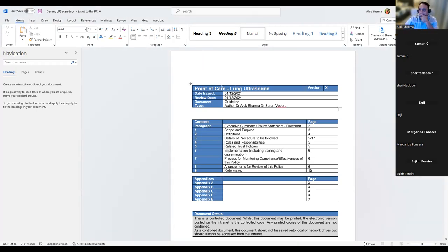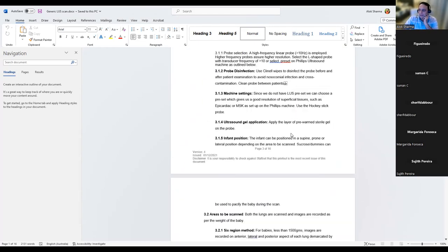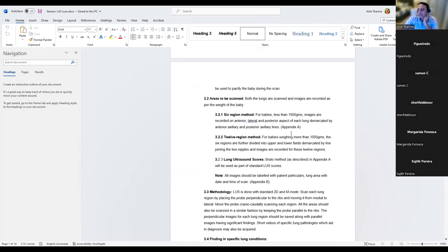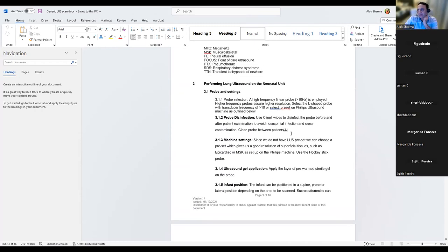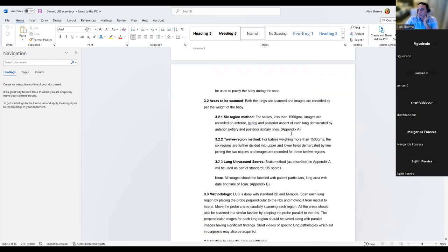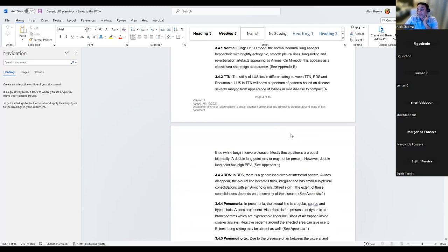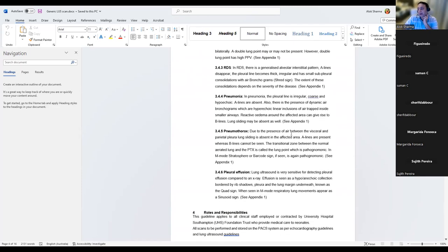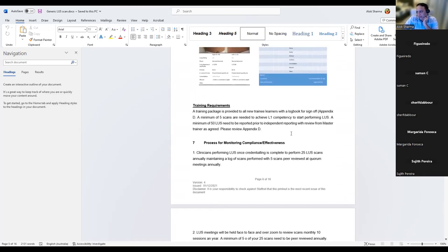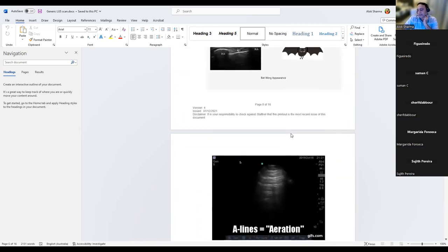Can you see this? Yes. Basically, I'll be sharing this with you. This gives you one approach to how you can produce a lung ultrasound guideline, and it's meant to be brief. I'm not interested in making it long. The idea is it starts with the definitions: how we want to perform lung ultrasound, standard definitions, what protocol we're going to use, the findings and how we define those findings as per our protocol in our unit, who performs lung ultrasound, how it's reported, what the training requirements are, and how we're going to implement them. And then it details everything else in the appendix.